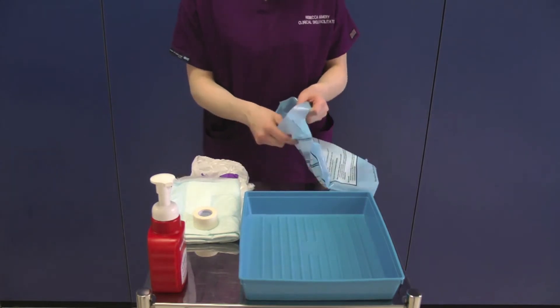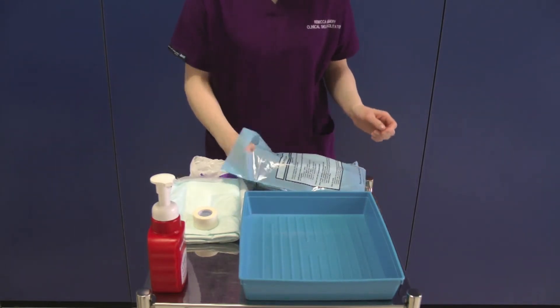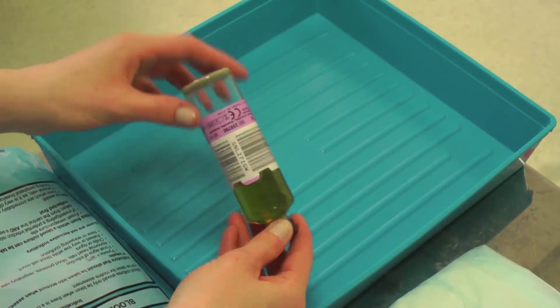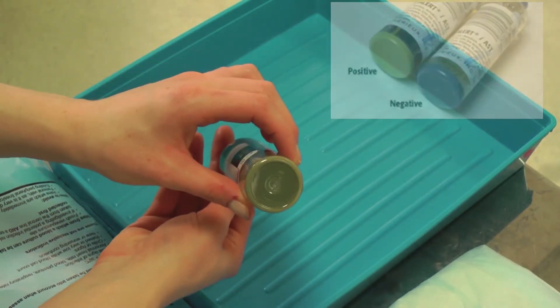Open the blood culture pack and arrange your equipment in the tray, ensuring all key parts are protected. Check the expiry date on the blood culture bottles. There is a barcode that must not be removed. Also check for contamination, which is indicated by a yellow discolouration on the bottom of the bottle.